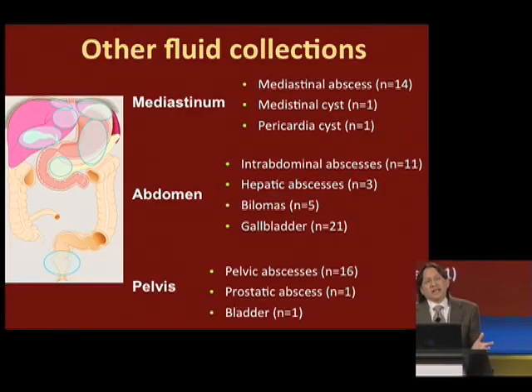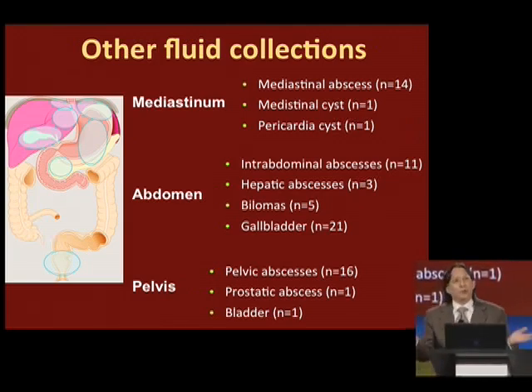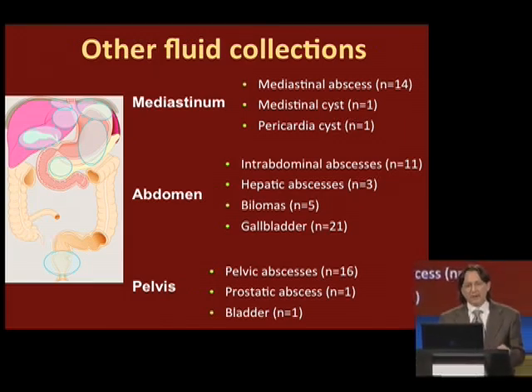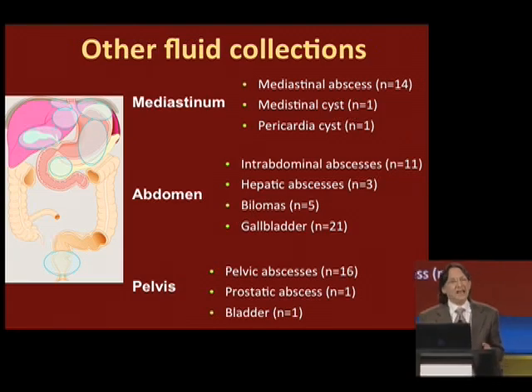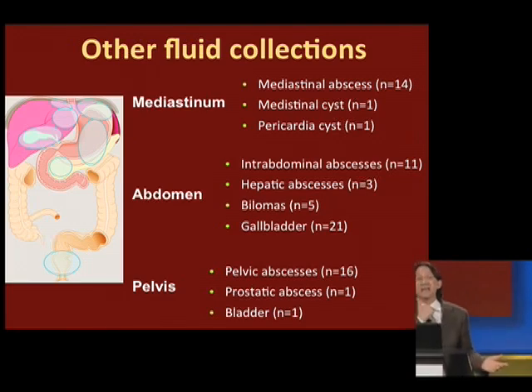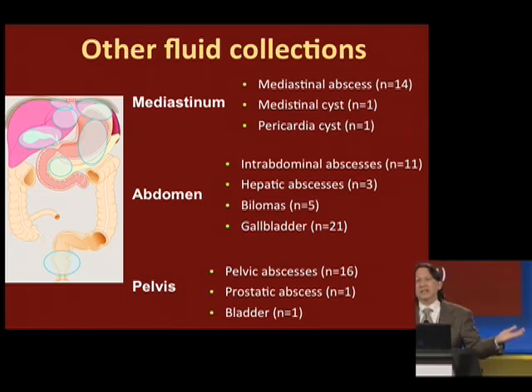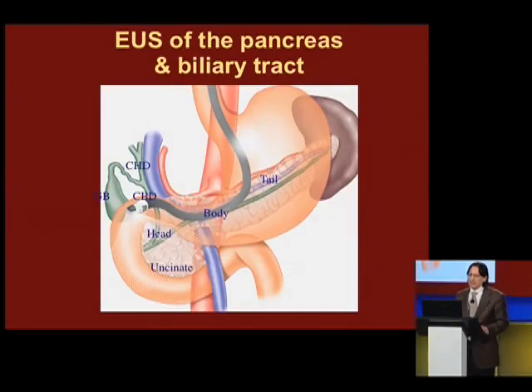And of course, it's not just pathologic fluid collections that we can drain, but it could also be a fluid-filled organ, like the gallbladder or the urinary bladder. And we can drain any fluid collection surrounding any part of the GI tract. Remember, the GI tract starts up here, so mediastinum, abdomen, pelvis. It's really our window to the entire body.